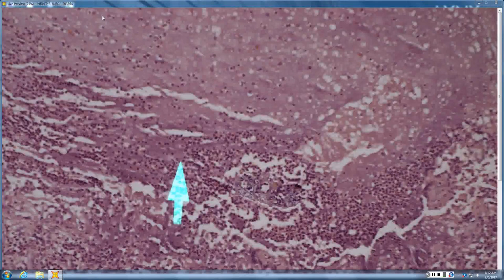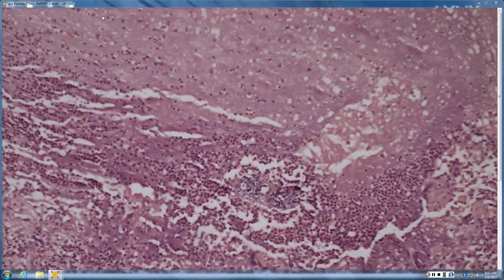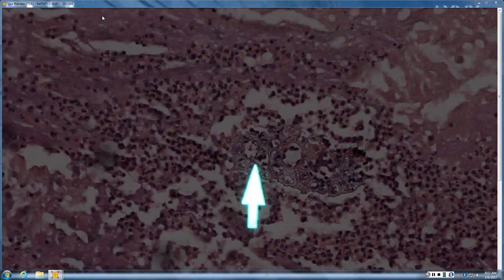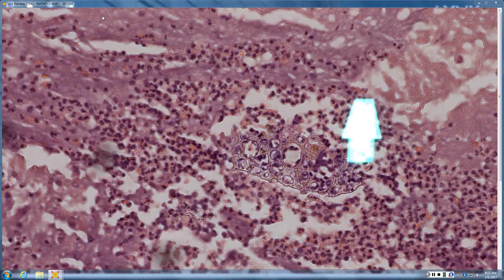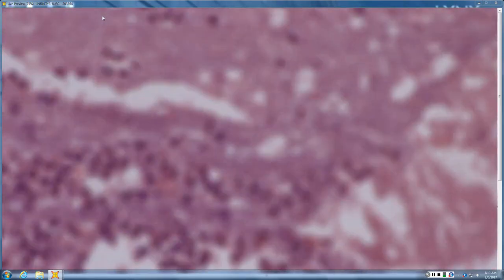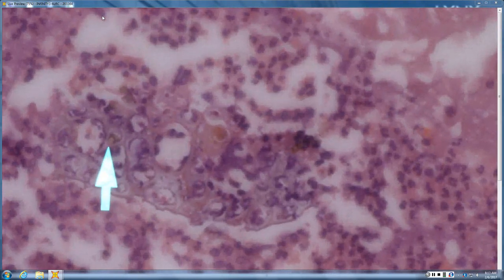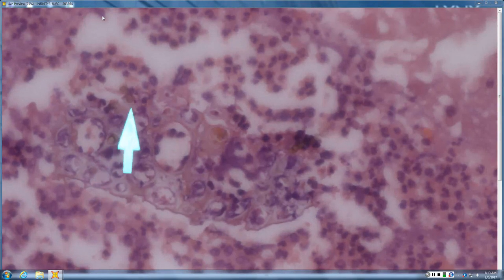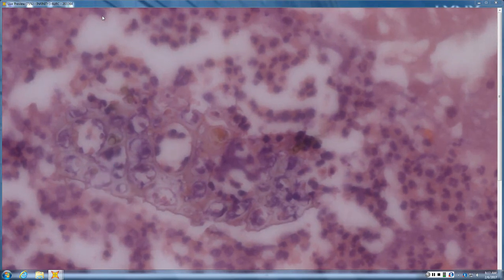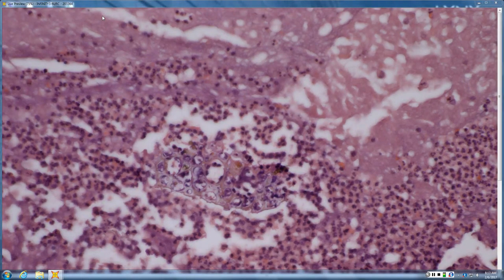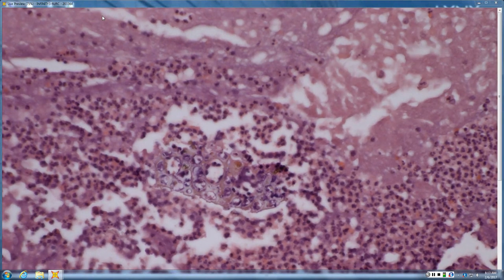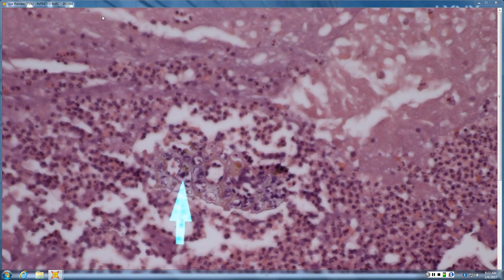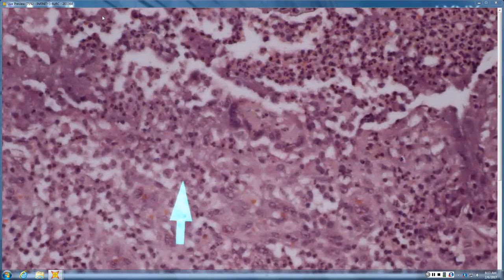Okay. So, we have some pus. And then what else do you have? It looks like rigid walls. Flip the condenser. So, we have cell walls. So, what do you think that's a bit of? Maybe splinter. Yeah, splinter. Yeah, splinter. And then any time you have a splinter, you're going to want to see is, did anything hitch a ride in the splinter? You have these little round, refractile brown things. If they're kind of hard to tell in these, some of them, you know, you could be seeing a cross section of hyphae, or if they just stay round like that and divide by fission, you know, form a little plate across them, then that would be good for chromo. Okay.